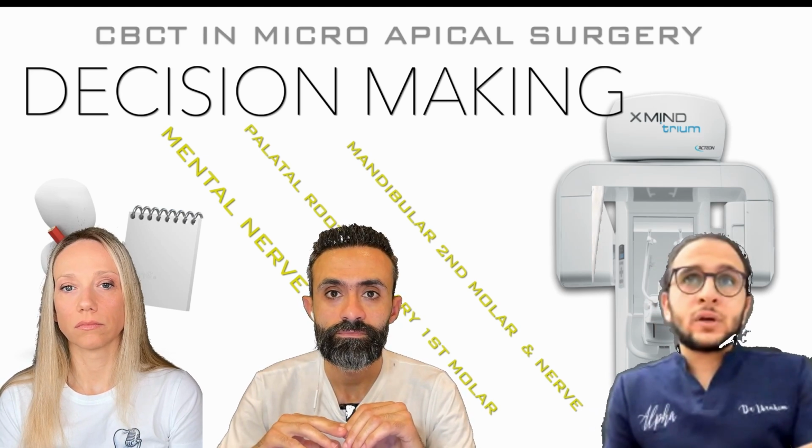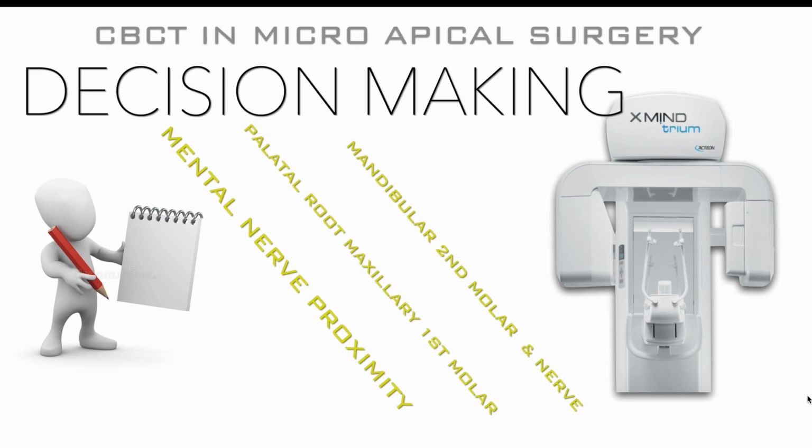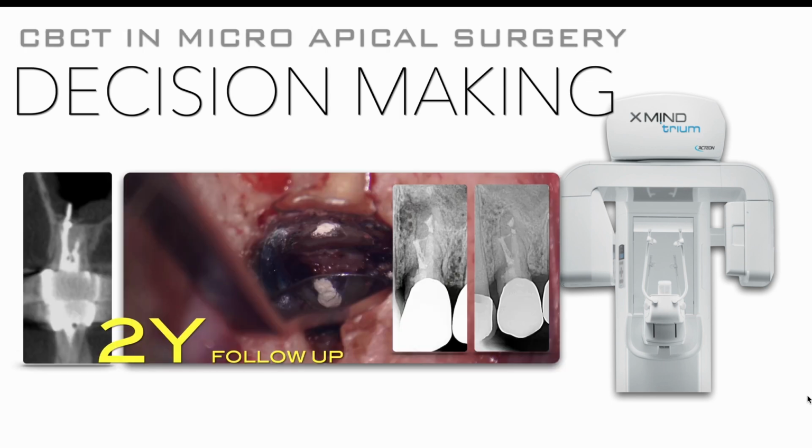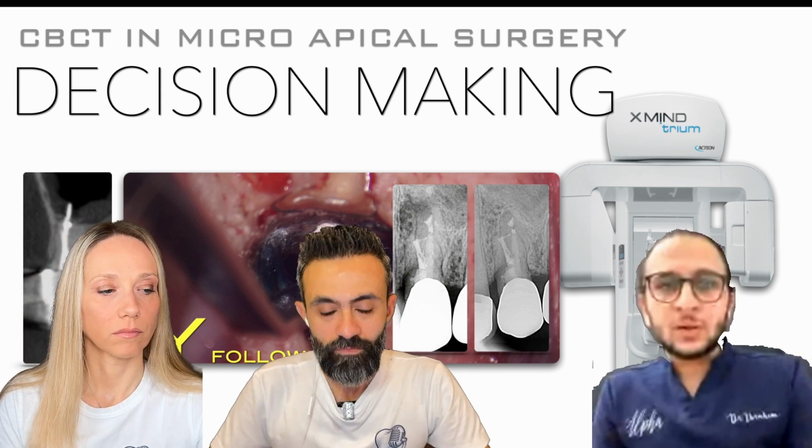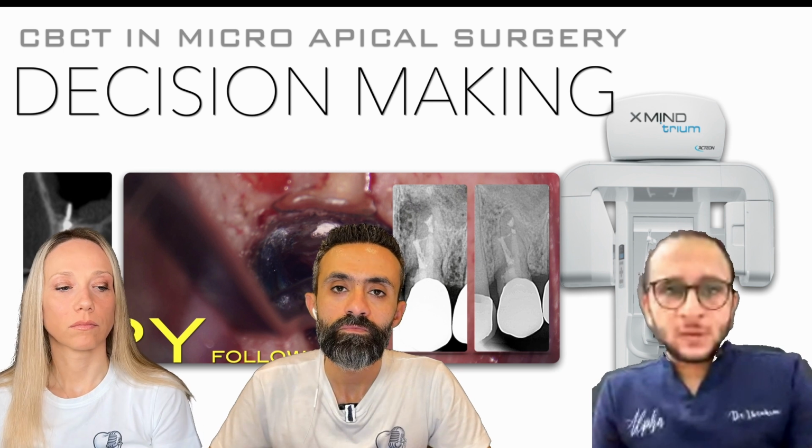As well, when we talk about the maxillary sinus, in some cases I have to treat a patient that has a filling inside the sinus or going through the sinus. So we have to use the CBCT in this situation to know exactly when to open or when to stop, because sometimes when you cut a little bit higher, you may harm the sinus.